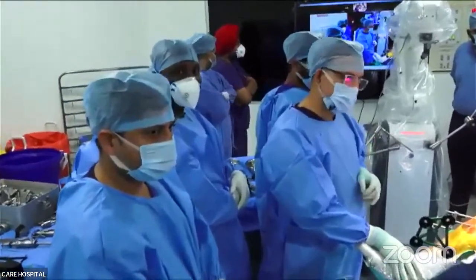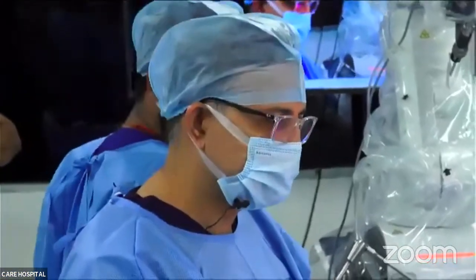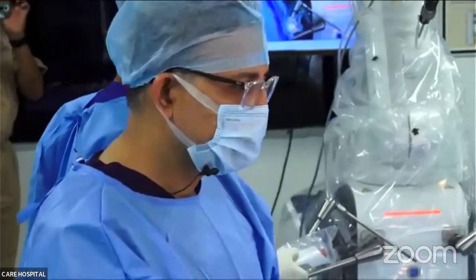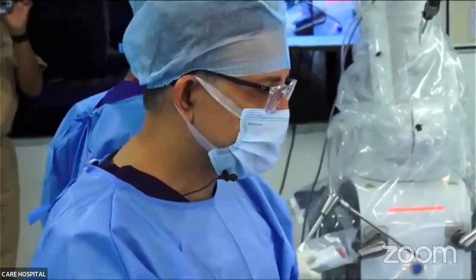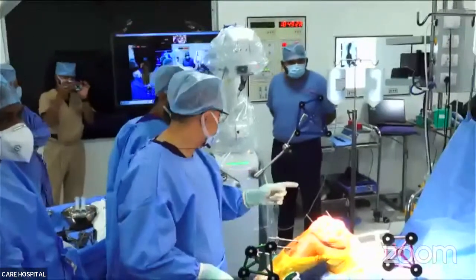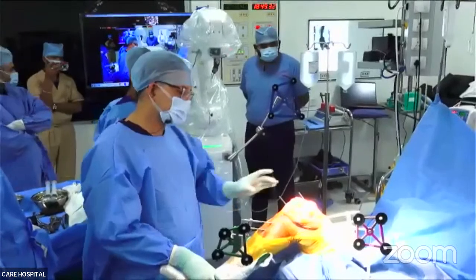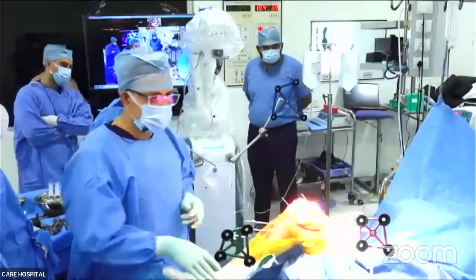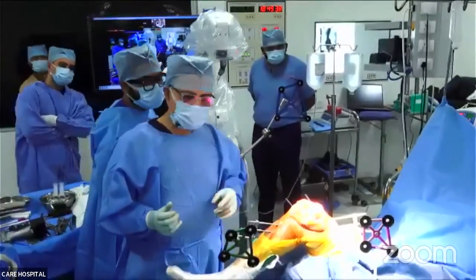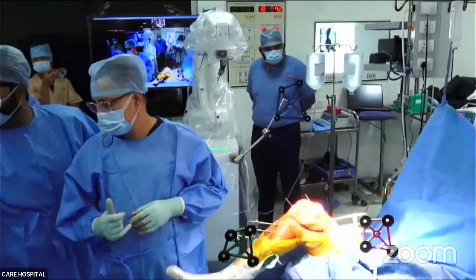Would you like to comment on the fixation of bone to the robotic arm and the haptic mechanisms that are working there? Like we have to fix the robot to the tibia and femur. So there are two systems. Either you can fix them with pins, or we also have these clamps. If you don't want to put pins, then you can use those clamps. Sir, just show me the clamps.